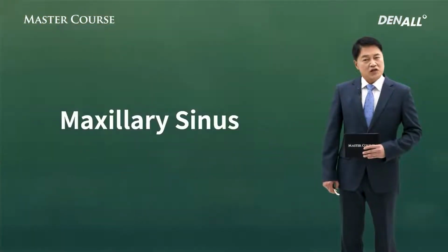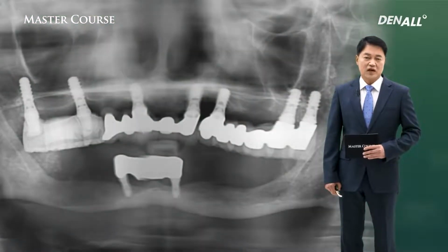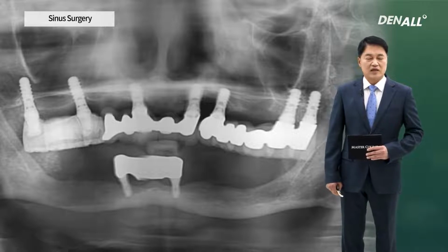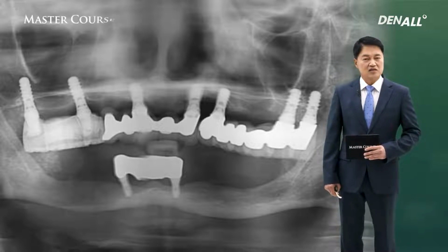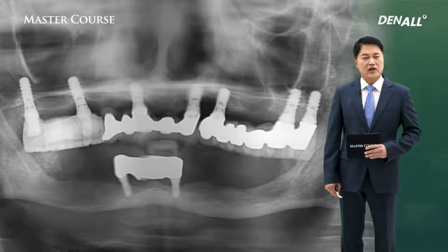Regarding sinus surgery, there's a very important message in this image. This is what I first took when the patient came in. The patient received implant from a different dental clinic. In the upper, there's bone resorption overall, and obviously one way or the other, implants were placed in the upper.